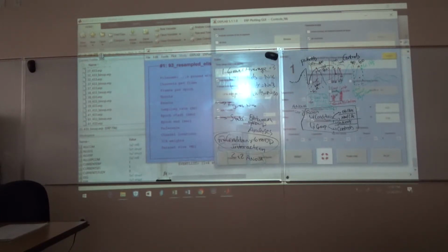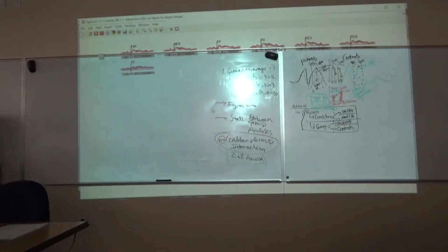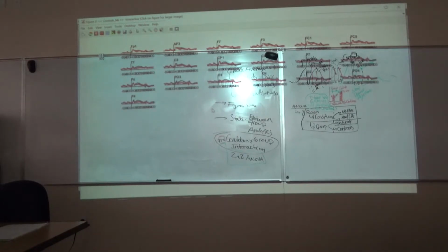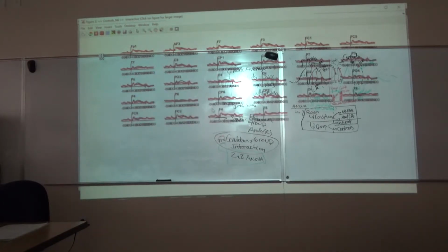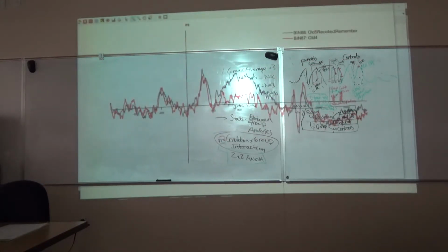And we are just going to do that. And let's say that we look at, it's like P3 here. Okay?